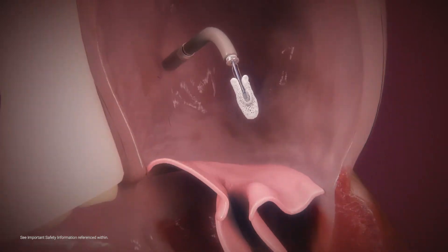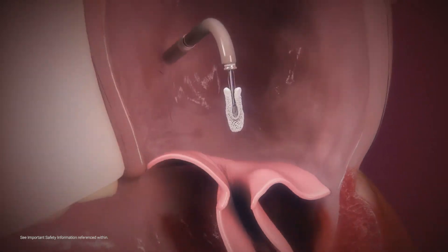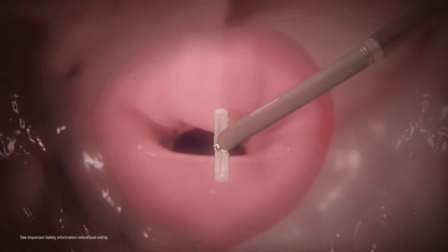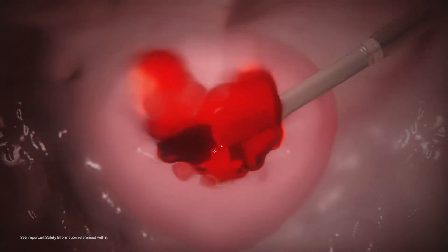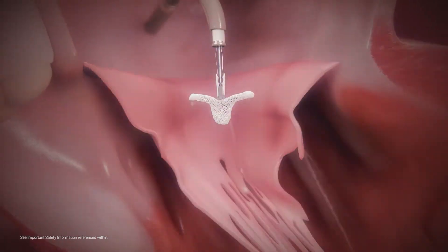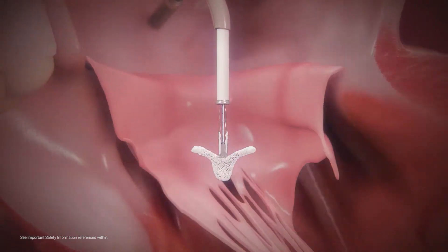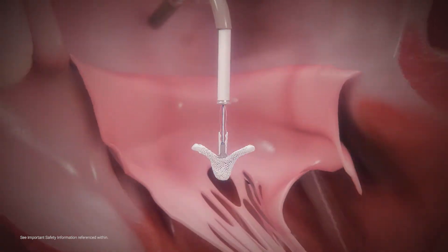Inside the left atrium, the clip arms are opened to 180 degrees and positioned perpendicular to the line of coaptation before crossing into the left ventricle. The clip is advanced into the left ventricle below the valve leaflets and retracted to grasp the leaflets.